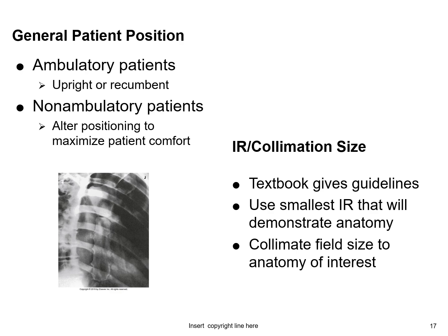So your non-ambulatory patients, those that are not strong enough or don't have the stamina to stand up, and those that have just been in a car wreck or some other traumatic injury event, and it's not wise to stand them up, should have no problem doing these exams on the table.